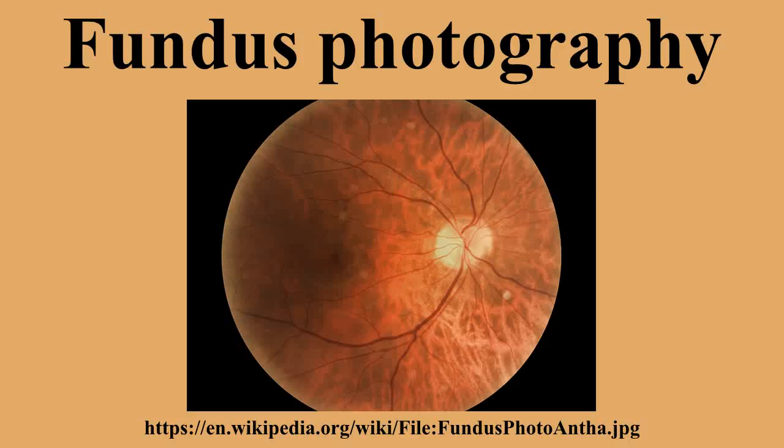It is imperative to instruct the patient not to blink when the fundus photo is taken. The patient may blink normally at any other time to prevent excessive drying of the eye. A dry eye may also lead to a blurred fundus photo. When dry eye is suspected, ask the patient to blink several times to lubricate the eye before continuing.